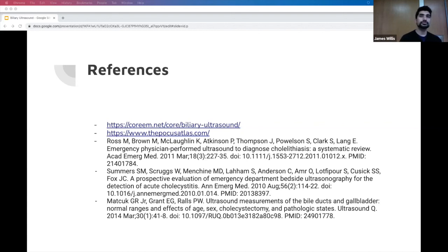The second question: I feel like with a lot of ultrasound studies, one of the issues is the imperfect gold standard, comparing ultrasound to CT. I wonder, are there any studies you've come across that, I guess the gold standard would actually be a tissue diagnosis, looked at diagnosis of cholecystitis on ultrasound, but then looked at the operative report? That's actually the best gold standard of everything.